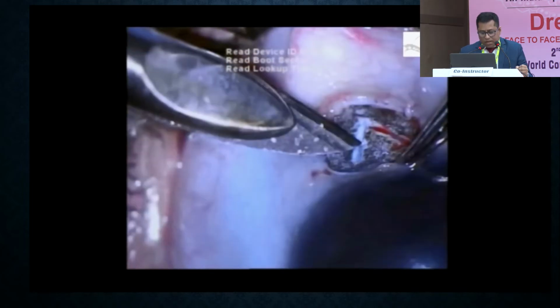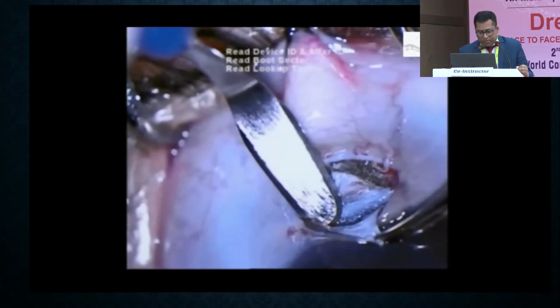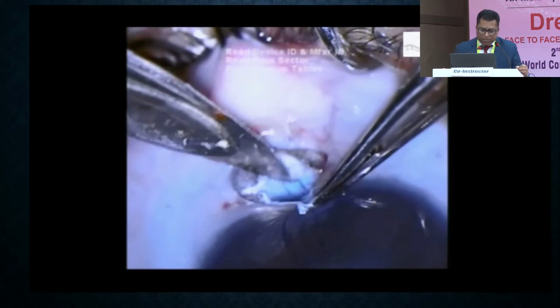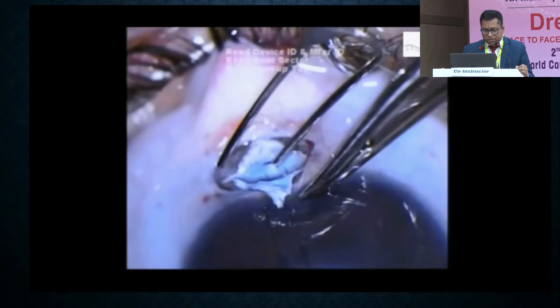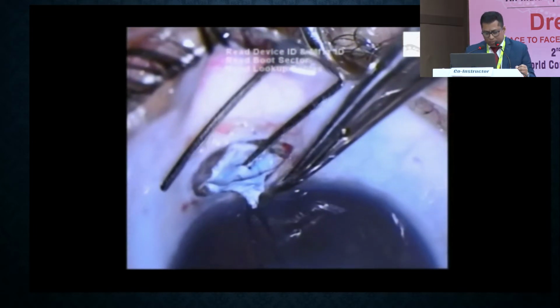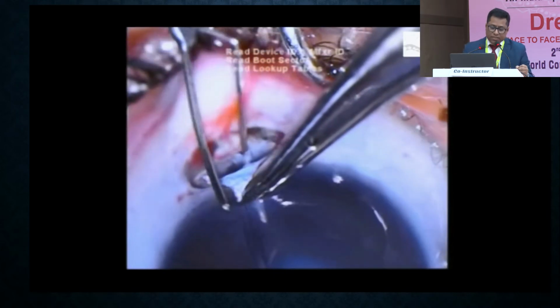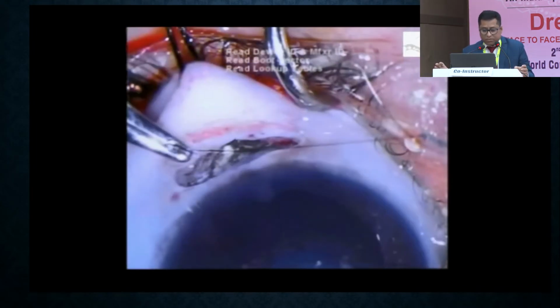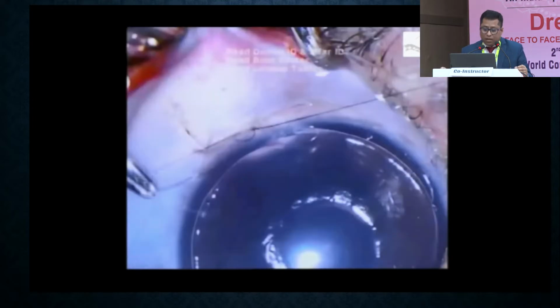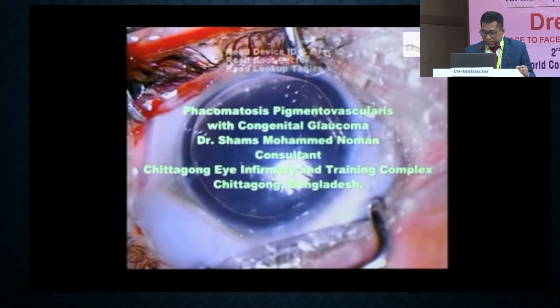I used to give a triangular incision, triangular flap. The patient was also associated with nevus of Ota, very thin sclera. Now I am doing the trabeculotomy, the most important part, with the Harms trabeculotome. Sometimes it is very challenging because it may touch the iris tissues, and as everything is very vascular, the possibility of bleeding and intraoperative hypotony is more, and ultimately we finish the surgery with a great success.